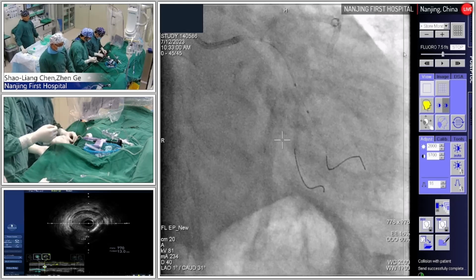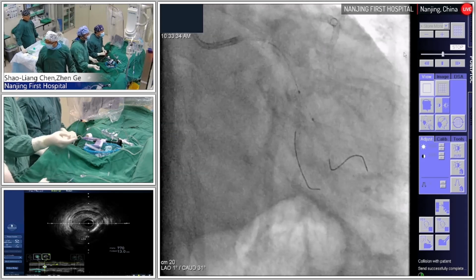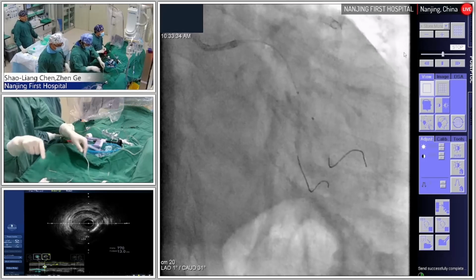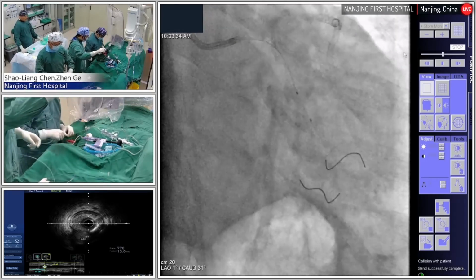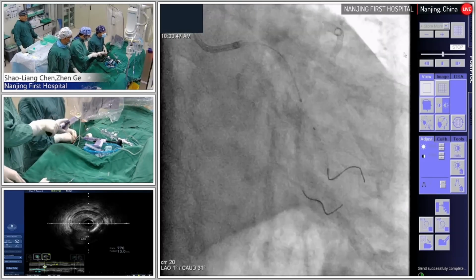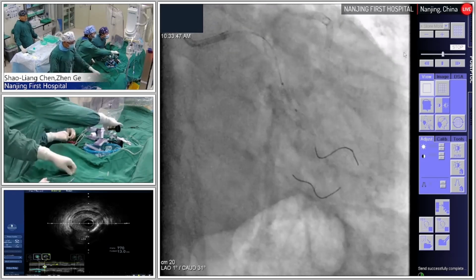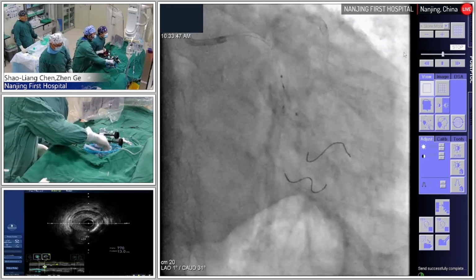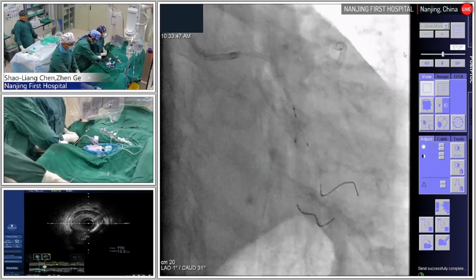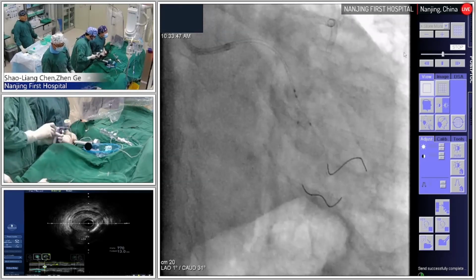It's very easy. Another important thing is that we don't want to trade off between ischemia and procedural cost, even if we need to use 2 stents for the double kissing crush technique. There are several clinical trials from DKCRUSH-1 to DKCRUSH-7, all confirming a lower rate of major adverse cardiac events during 1 to 5 years follow-up.